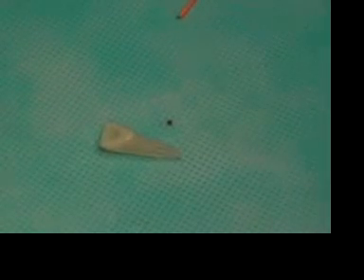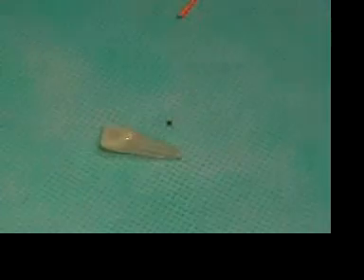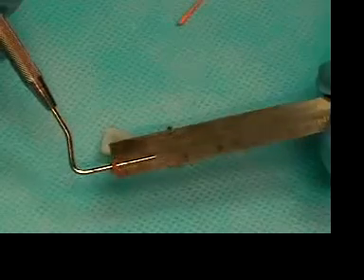Our working length in this tooth is 24 millimeters. So we take our larger plugger, which is a number 11, and we measure the plugger to 12 millimeters.